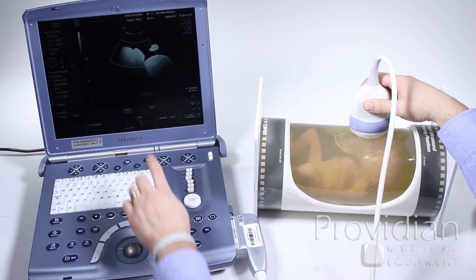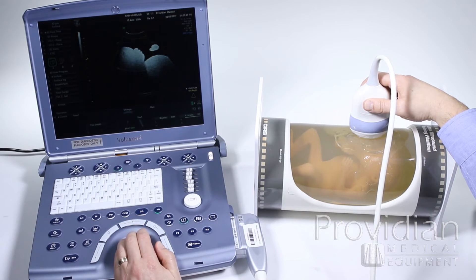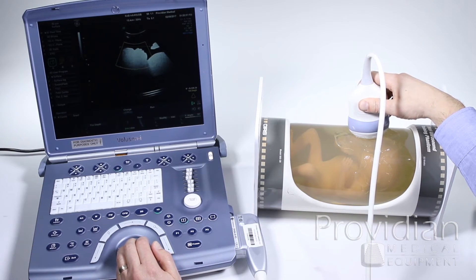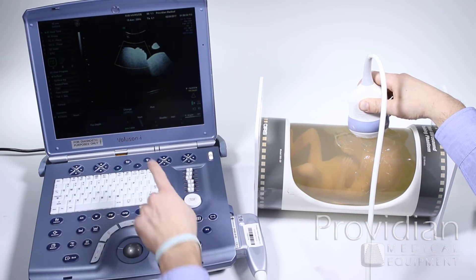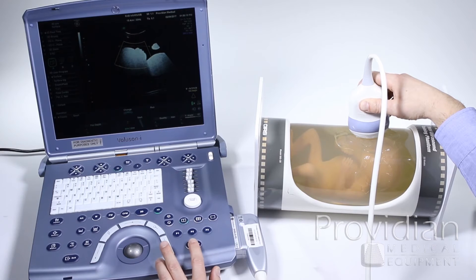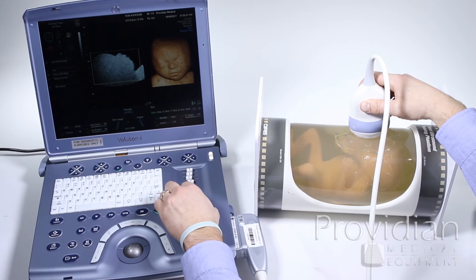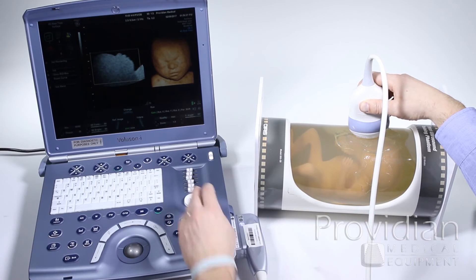We have our cheat sheet down here. The ROI box can be changed — you don't want to go too deep, but do try and get the whole face in there. The wider you go, the slower the frame rate, so try and just get the baby's face in there. Put the green line above the baby's nose and try to get the whole head in there. Then hit the right key or freeze — freeze will work on any Voluson. There is my 2D image on the left with the nose pointing up, and on the right I'm seeing the 4D image.